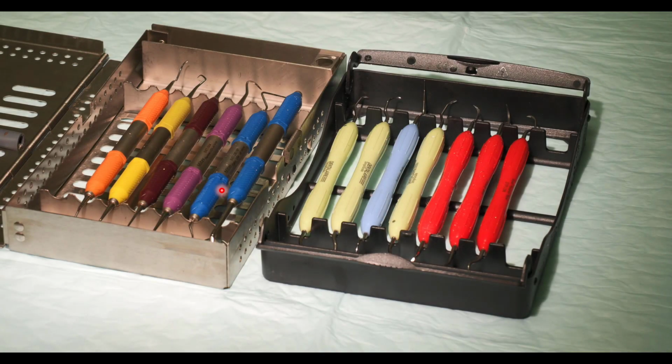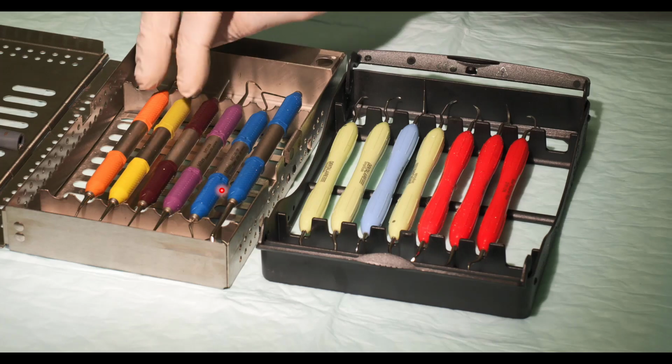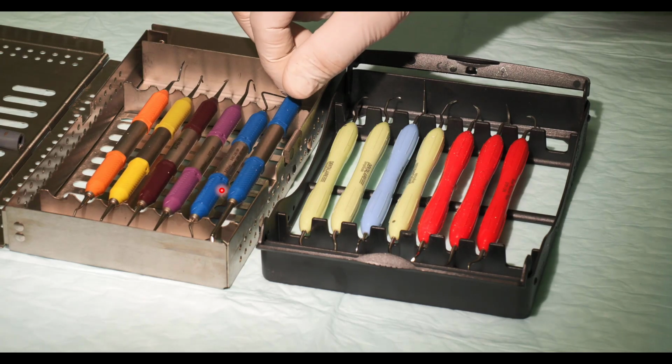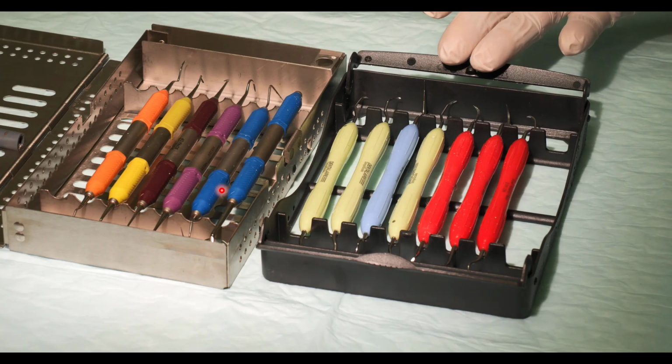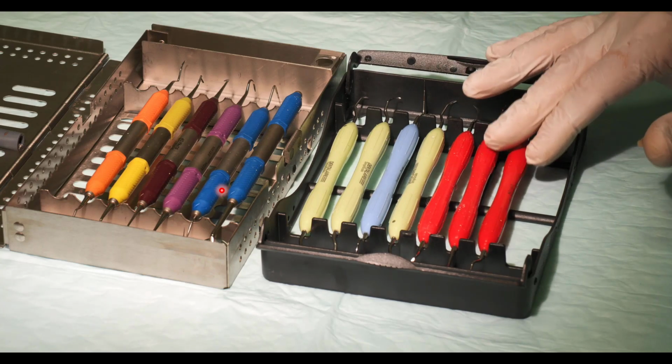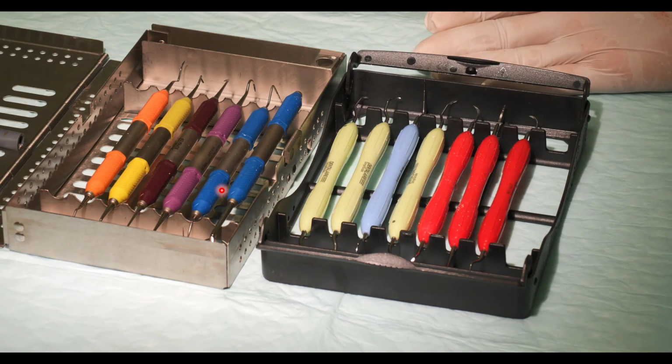So when it comes to hand instrumentation, there are a ton of manufacturers, a ton of different options. They're all fine. Two easy examples that we recommend. This is the Weldon Periodontal Kit created by Integra Miltex. It's got 2 curettes, 2 scalers, a mirror, and a probe explorer. And then this is the simple scale kit put together by Dental Aire. There's scalers, there's probe explorers, there's curettes, everything you need, nothing you don't.